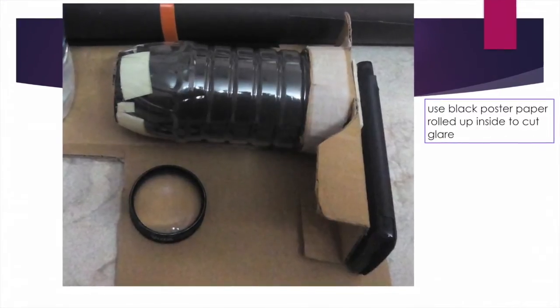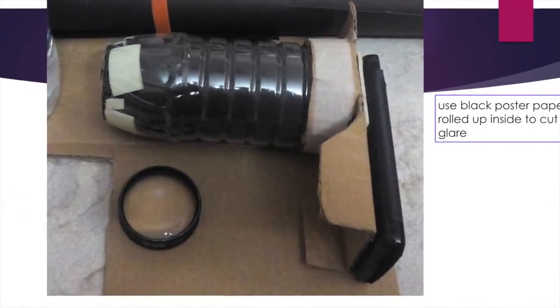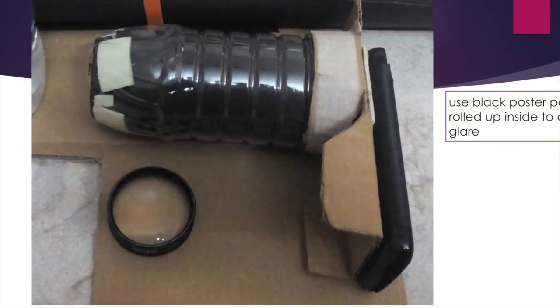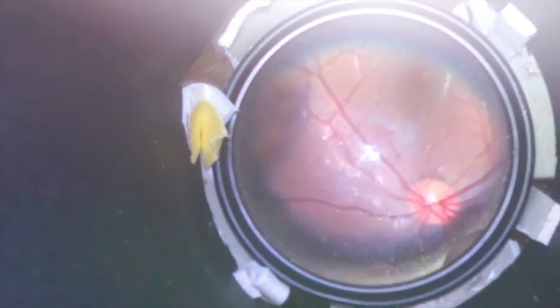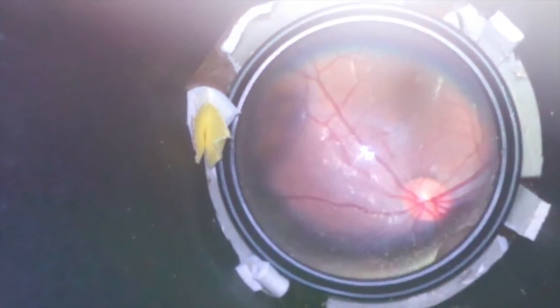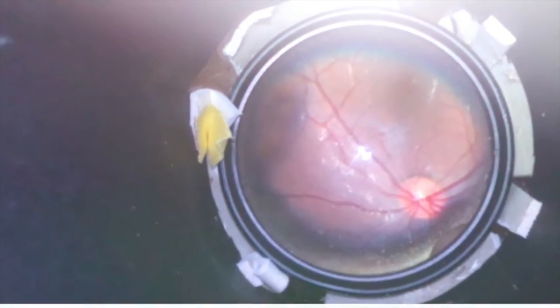Use a black poster paper rolled up inside the water bottle to control glare. Hold the entire thing, turn on the camera — the video light should be on the always-on position — and this is the kind of good fundus picture that you can easily capture.